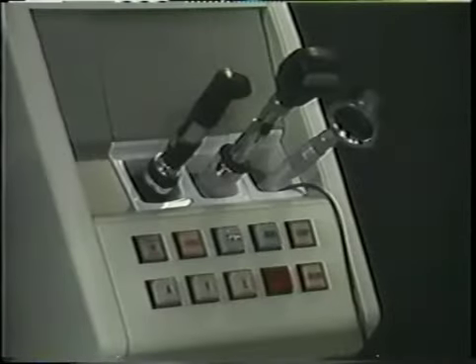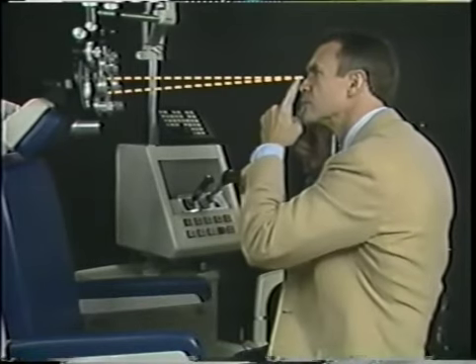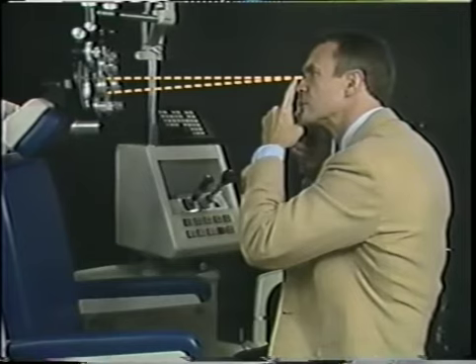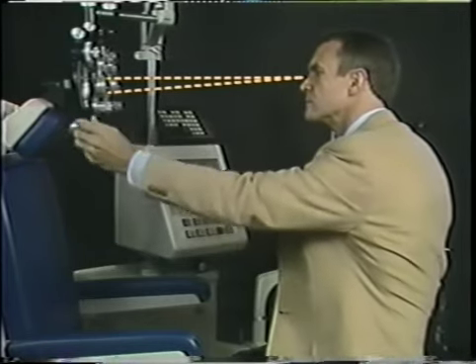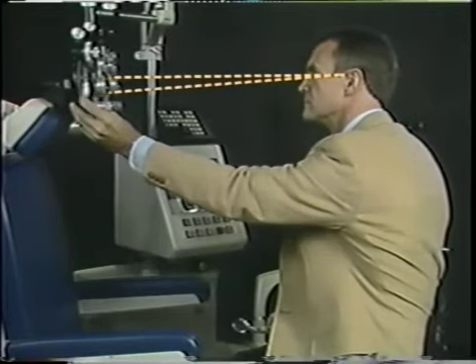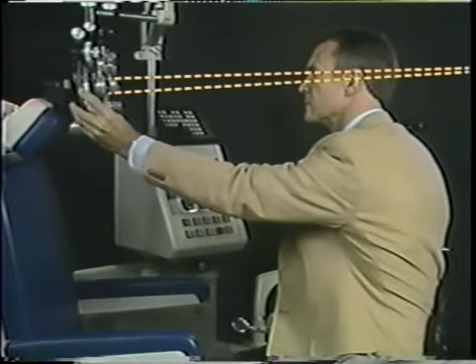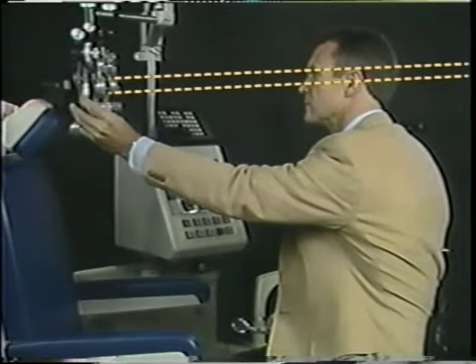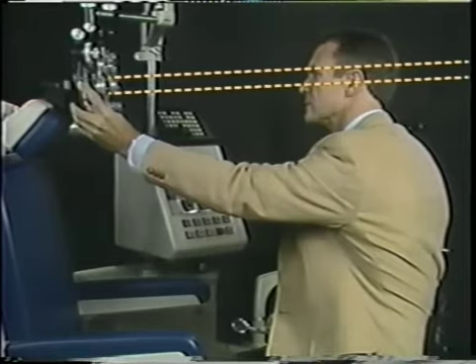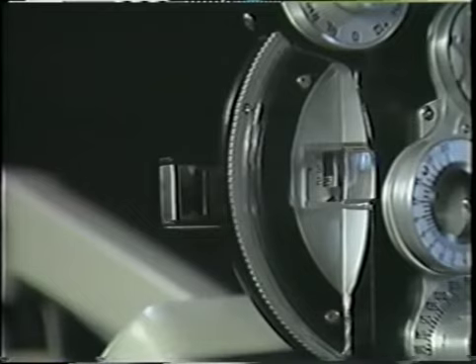You're not yet ready to record the results, though, or even to move on to subjective refinement with a patient, for the eye's far point is still at the working distance. That is, the eye is still focused at the position of the retinoscope. To move the far point to the far wall, or essentially to infinity, you must change the sphere 1.5 diopters in the minus direction. Again, there's no need to look at the numbers. Simply dial 6 clicks up. If your working distance is shorter than normal, you may find that 7 clicks up gives you best visual acuity.